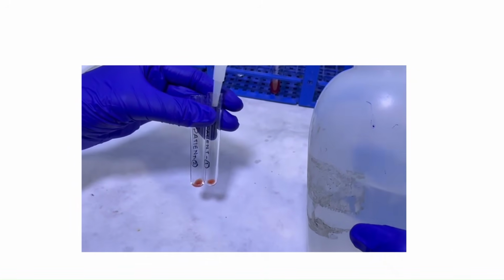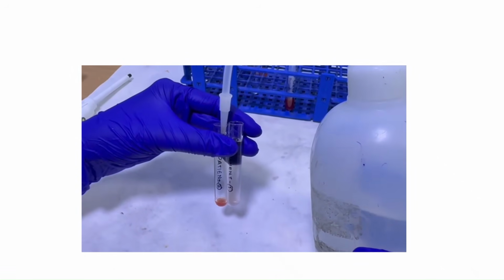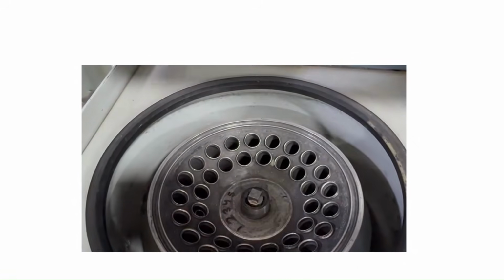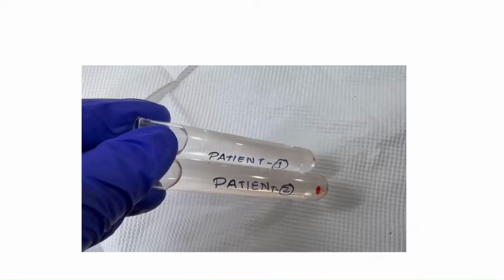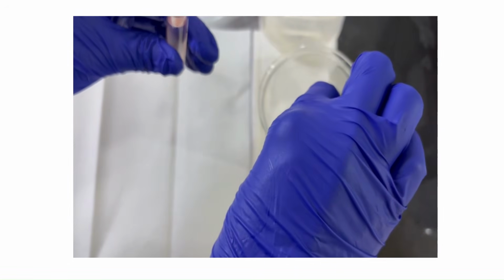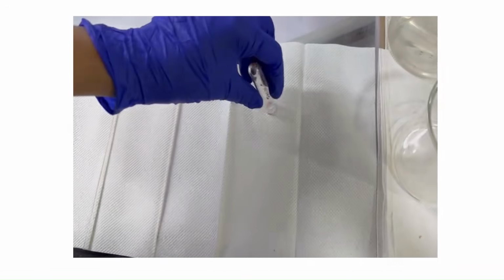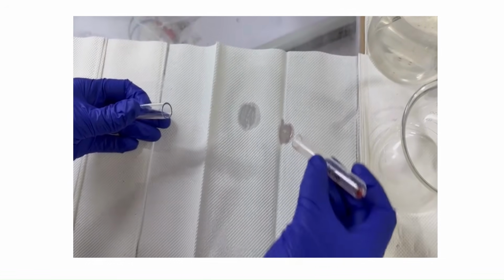Now we are going to wash the red cells. Fill 3/4 of the test tube with normal saline and centrifuge it 3 times. After properly balancing, we are now going to centrifuge and wash the red cells. Perform this wash 3 times. This is the third wash. Gently decant the saline without disturbing the cell button. Gently tap the remaining saline onto a tissue paper.